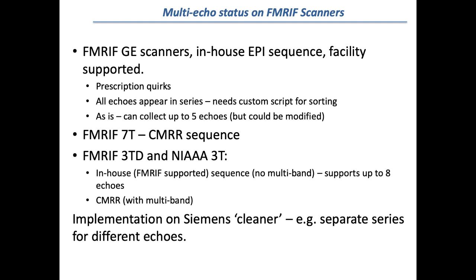So with our GE scanners, we started off with the basic EPI sequence. Because of some internal design limits and how many dimensions were available to us, we weren't able to do as clean an implementation as we were able to on the Siemens. But we have a sequence that runs on the scanner, reconstructs on the scanner.